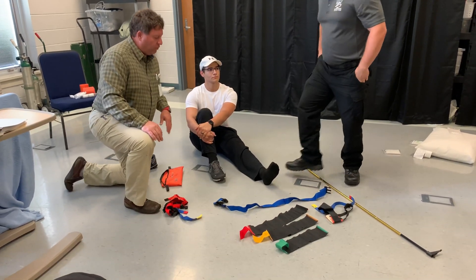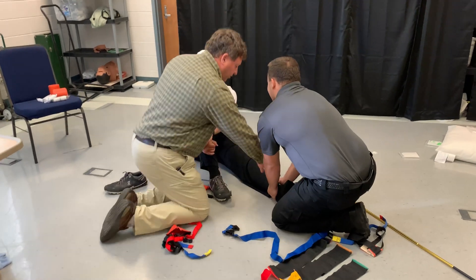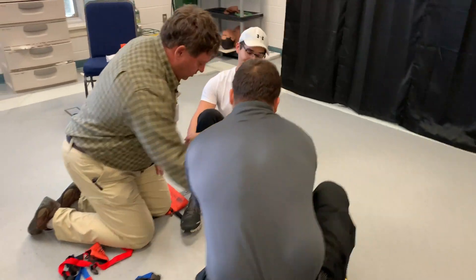Our partner is going to come and hold manual stabilization and a little bit of traction, and then I'm going to assess circulation, sensory, and motor function.